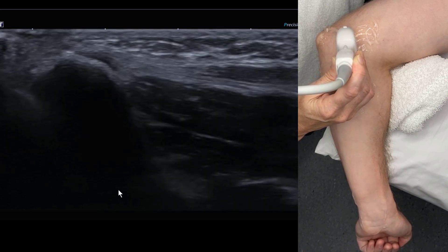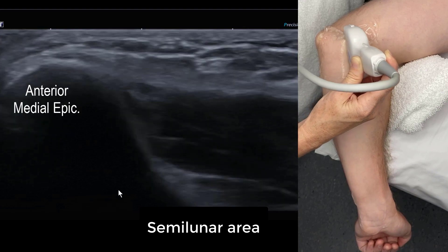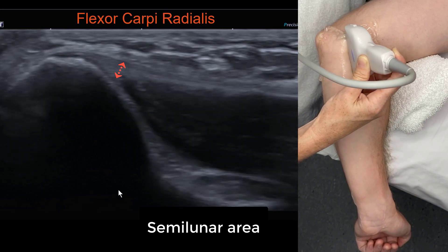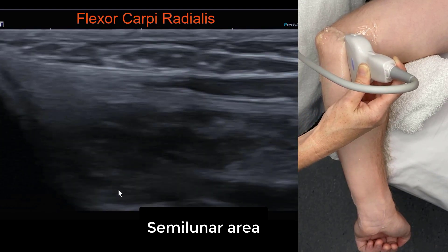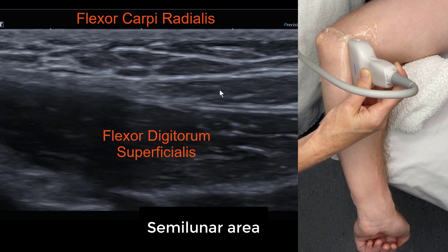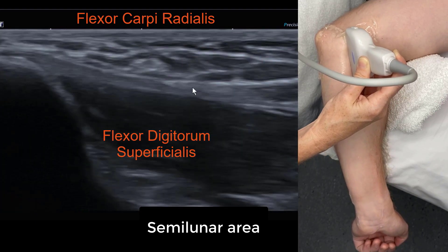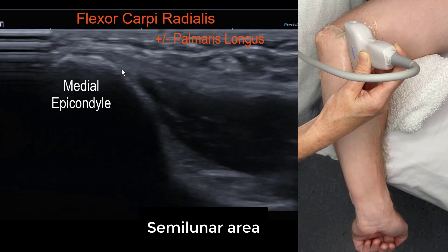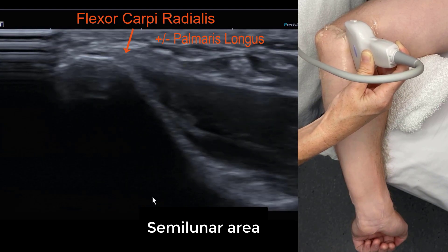The palmaris longus tendon fibres also blend in with the anterior third of the common flexor tendon, which is flexor carpi radialis. This is where most of the pathology occurs. We can see a triangular muscle there overlying FDS, and palmaris longus fibres may blend in here.